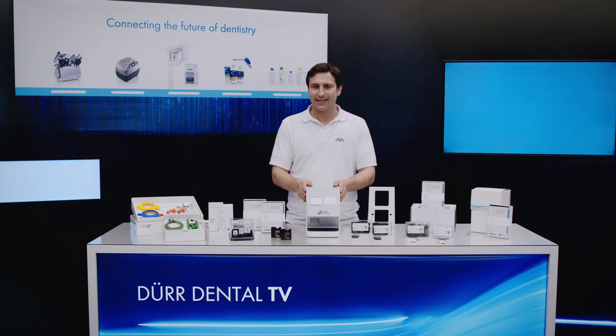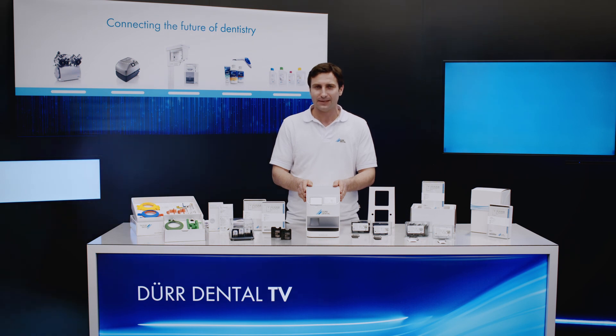VistaScan NanoEasy is a compact, very quiet and high-grade image plate scanner that offers exceptional image quality. It particularly stands out with its remarkable reliability and ease of operation. In addition, it also offers intelligent functions in conjunction with the VistaScan IQ image plates.